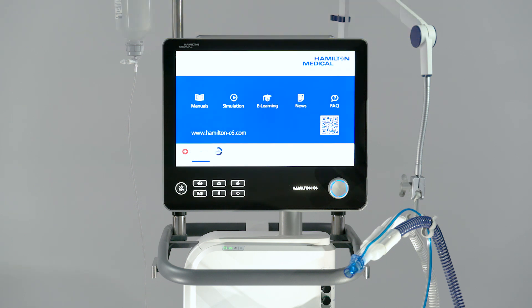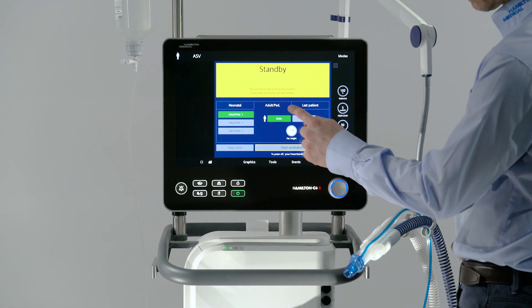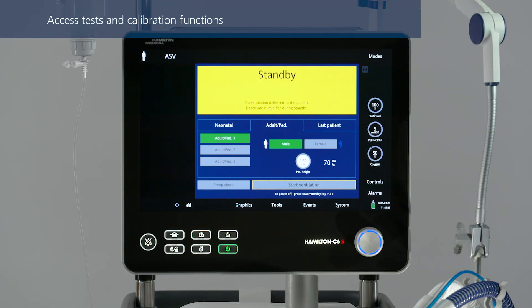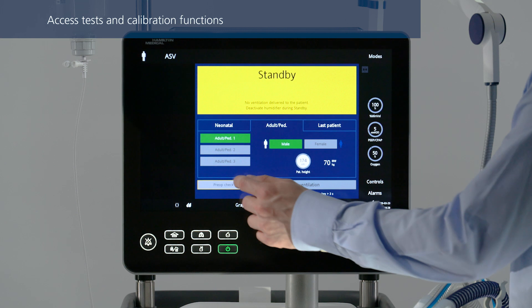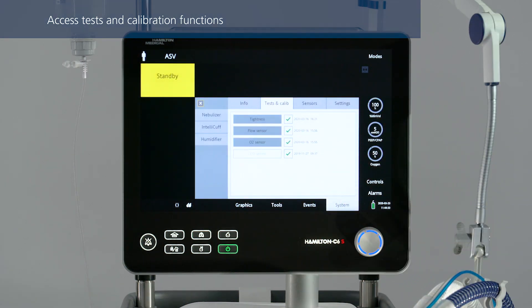The ventilator runs a self-test. When that is complete, select the correct patient group. To access tests and calibration functions, touch pre-op check in the standby window. The tests and calibration window opens.